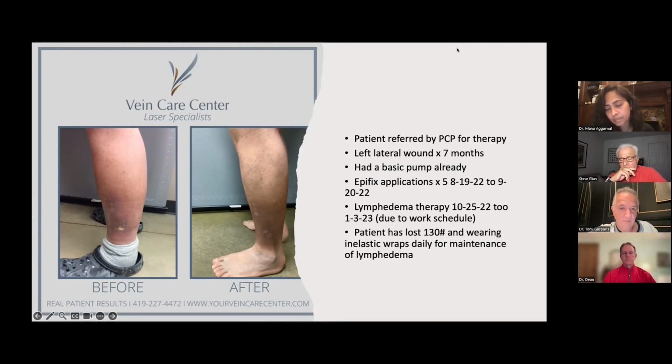And how about patients, anybody on the panel, what, in general, since we already said venous disease and lymphedema are among the main causes of swelling in the United States, are we almost always looking at the venous function in these patients as well? I mean, we are more often than not. Steve, you want to tell us when maybe you don't need to, or in general you should?